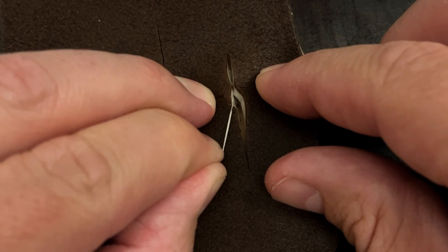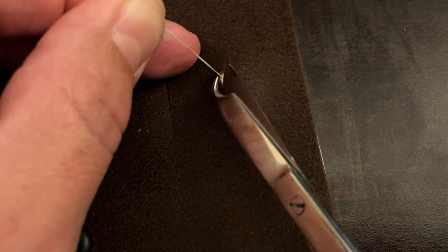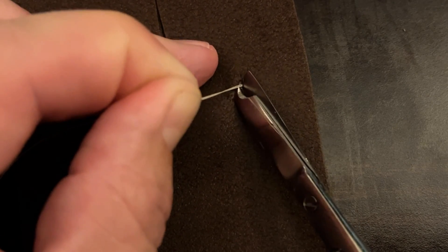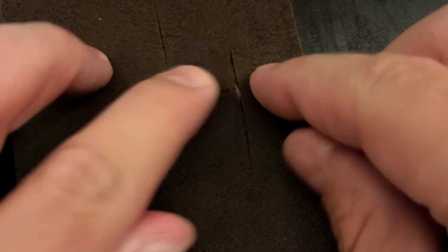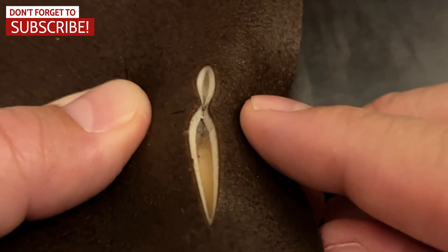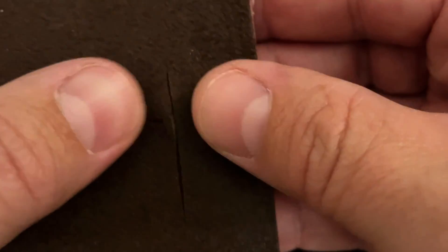The knot should be down underneath the dermis in the subcutaneous fat. I want to pull up with my left hand, then with my scissor get down as close as I can to the knot, rotate the scissor a little bit, and cut. That's going to allow the knot to drop down underneath the dermis. It's pulled the dermis together and the knot is now deep — you can see it's well approximated and lying flat.